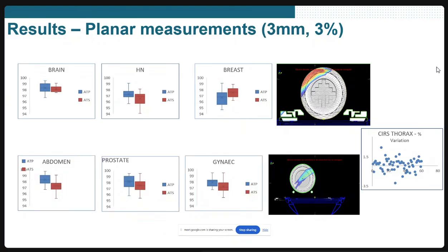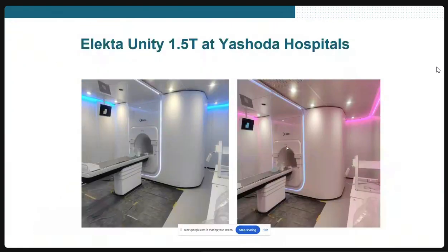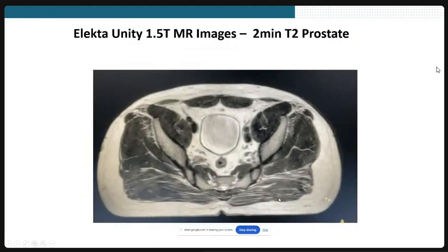So we have MRI compatible patient-specific quality assurance tools, which we use to do dose calculation for planar and absolute dose. This is how the machine looks. You can see it is a very nice, beautiful machine with good interiors.